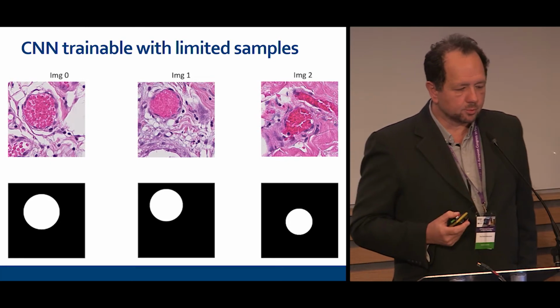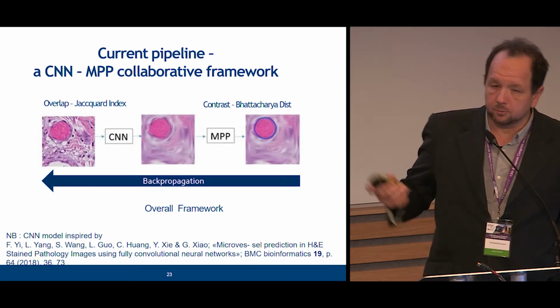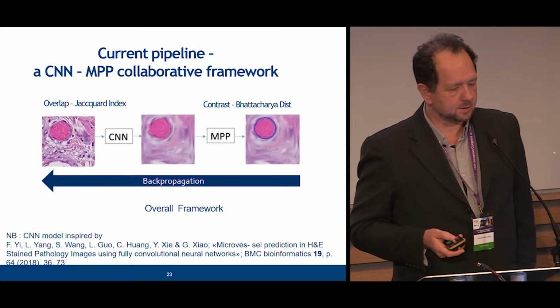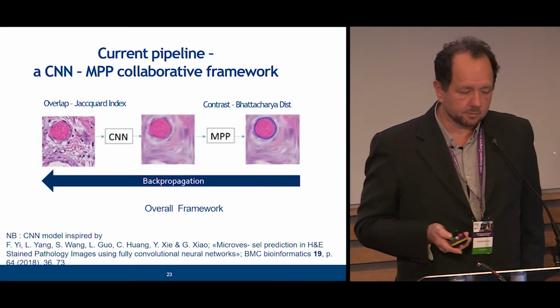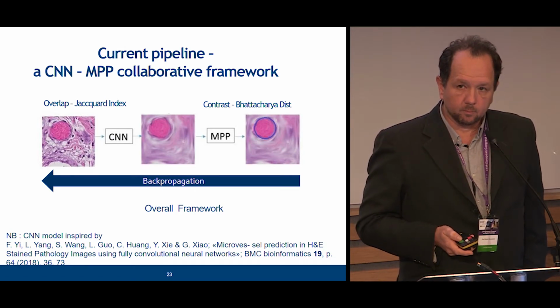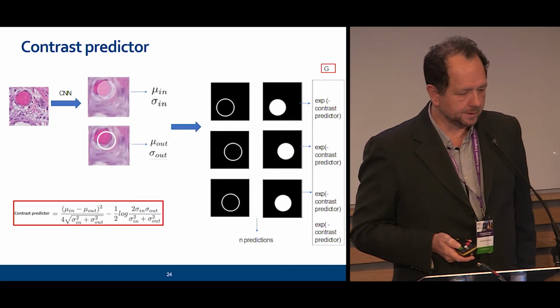So we did manage to improve the previous work, which has been done in 2018 only with the CNN, from the point of view of the accuracy, precisely, which is very bad for this kind of applications. It used to be like 0.1. Now we are reaching something around 0.5. Still a long way to go, but that means that this is the state of the art, right, in this area right now.